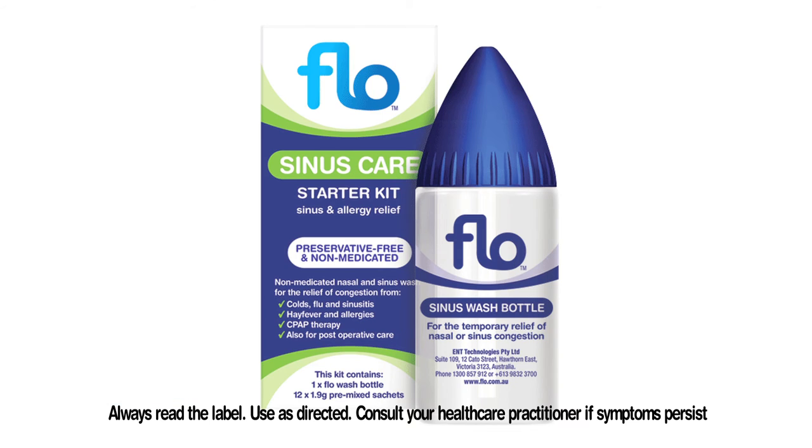Washing the nose and sinuses with flow sinus care helps to wash out thick sticky mucus and reduce the concentration of nasal irritants. It also helps to decrease the discomfort from sinus congestion. In patients with allergies, washing with flow sinus care about 20 minutes before using medicated nasal sprays has also been shown to improve results from those sprays and to improve overall allergy symptom control.